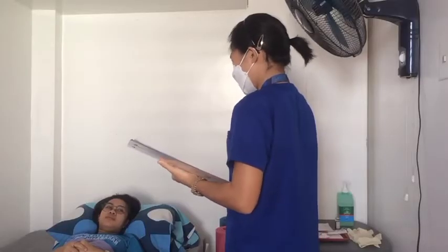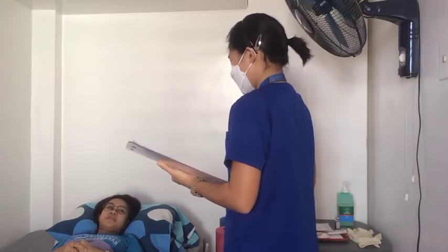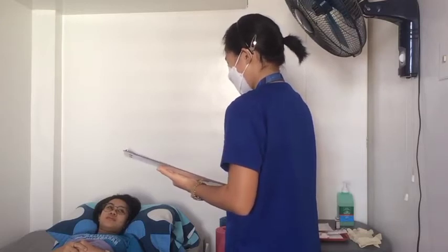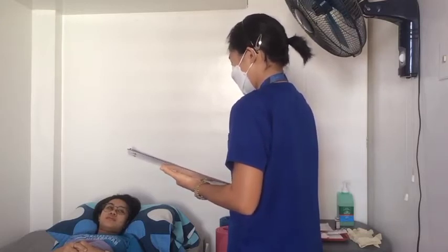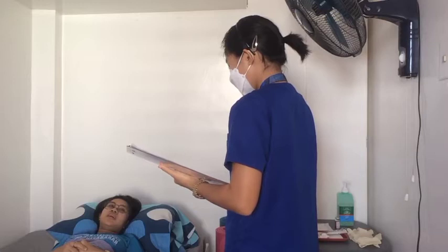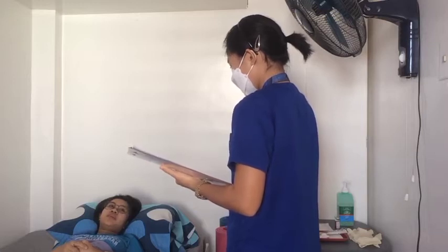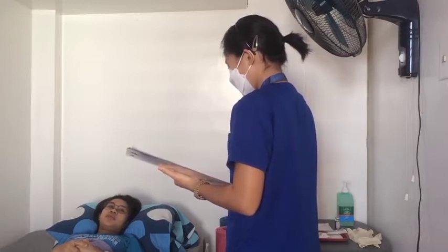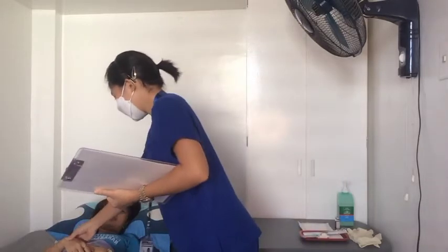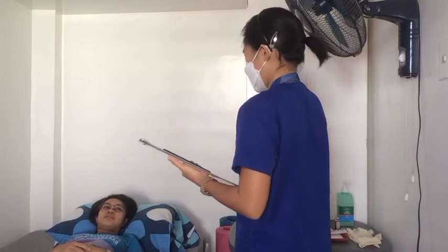Good day, ma'am. How are you doing? I'm doing good. I'm Bridget Survey, student nurse, and I'm here to demonstrate the administering of intramuscular injection. So, may I first verify your identity by stating your complete name, including your surname, your first name, and also your birthday and your age. I'm Christine Aleda Esteve. My birthday is July 25, 2004. I'm 17 years old. Okay. May I see your wristband? Okay, thank you. It seems that you're the patient.